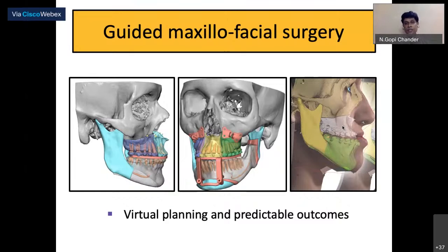So that's the advantage of your digital systems, in terms of guided maxillofacial surgeries, especially in correcting your jaws. That's for cosmetics. You can really predict the outcomes, give it to the patient, project it, obtain the consensus, and your precision is also going to be accurate in terms of your surgical skills.